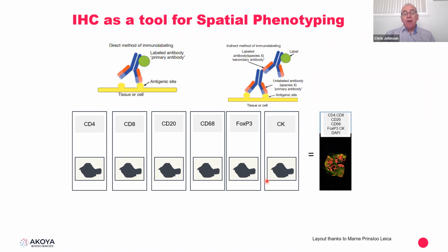The advantage of it is that we can actually see the location of the biomarkers on a single cell, on the same single cell, whereas in this kind of format, each section is from a different level within the tissue block. So there's no guarantee that what you're seeing and trying to associate with a single cell are necessarily single cells. So having a single slice with all the dyes on it is actually a good approach.